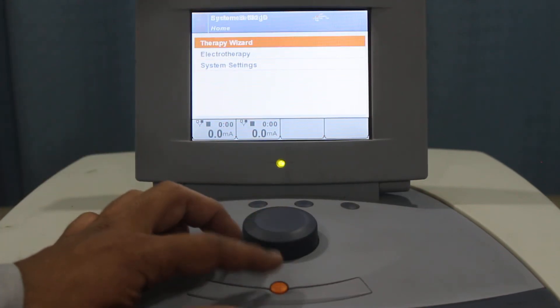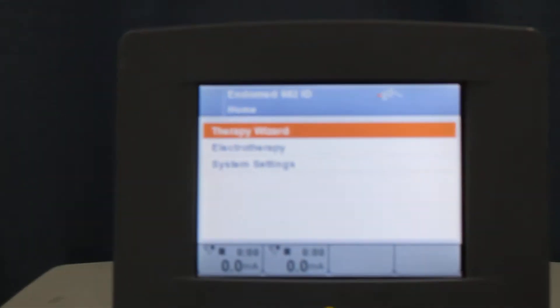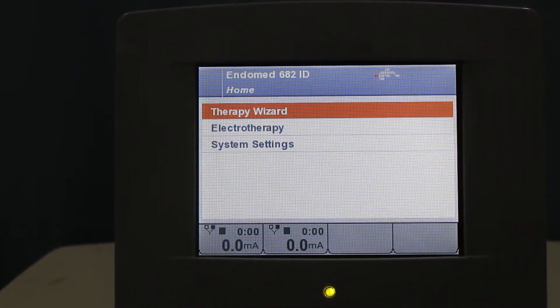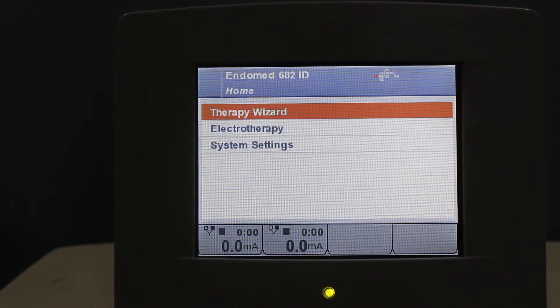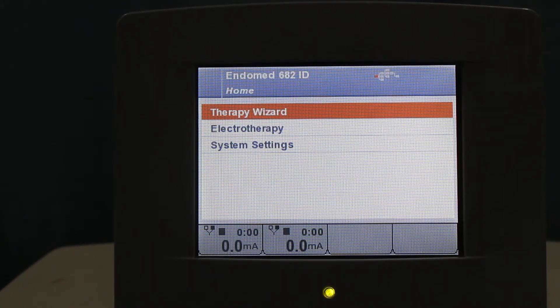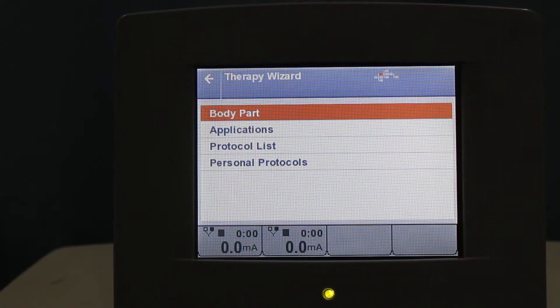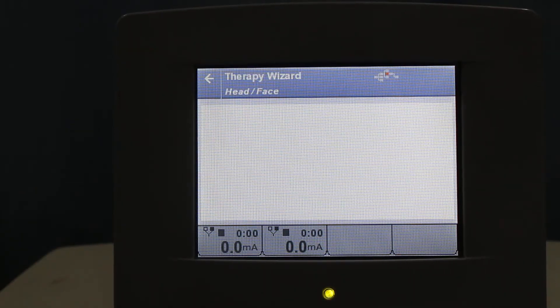We need to go back to the home menu. If you are an advanced user, I'll try to focus on the main screen so you can clearly see what is written on it. You can see the Therapy Wizard, Electrotherapy, and System Settings. If we talk about the basic settings, you can choose from the Therapy Wizard, select a body part, and you can also use the applications or protocol list or personal protocols.